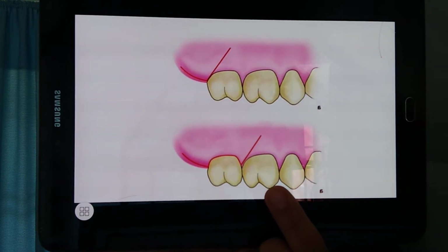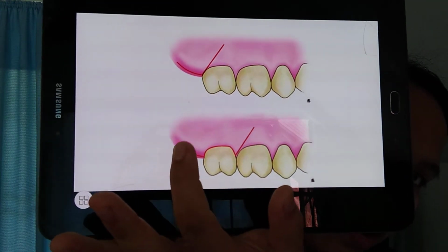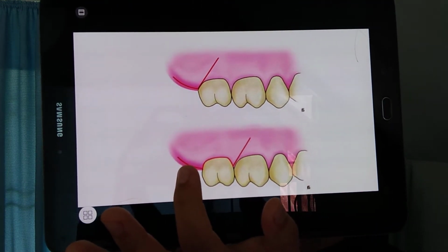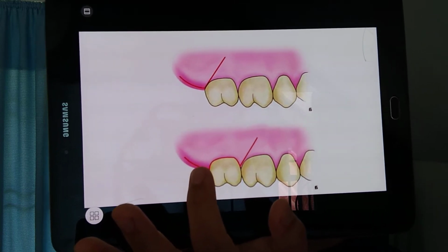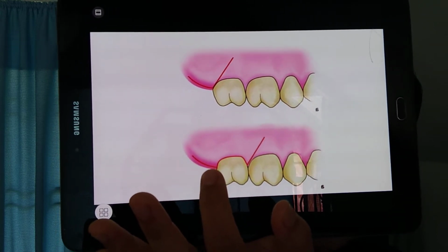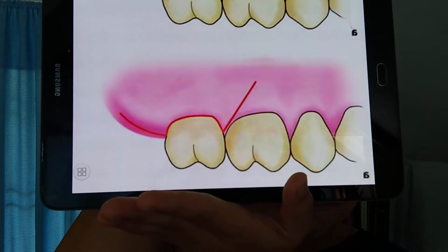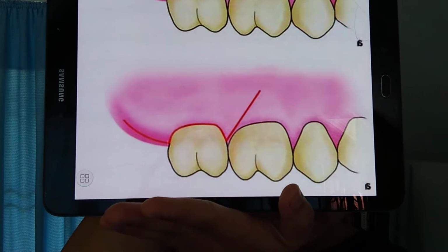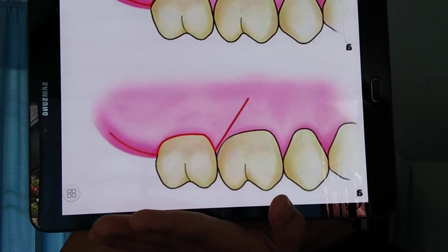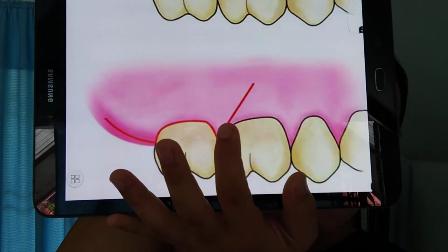The incision for creating the flap begins at the maxillary tuberosity, here on this one, and extends as far as the distal aspect of the second molar, continuing obliquely upwards and anteriorly, a vertical incision to the vestibular fold. Now, in rare cases, as you can see on the second picture, when the impaction is deep and a satisfactory surgical field is necessary, or when the impacted tooth covers the roots of the second molar buccally, then the vertical incision may be made at the distal aspect of the first molar, on this one.